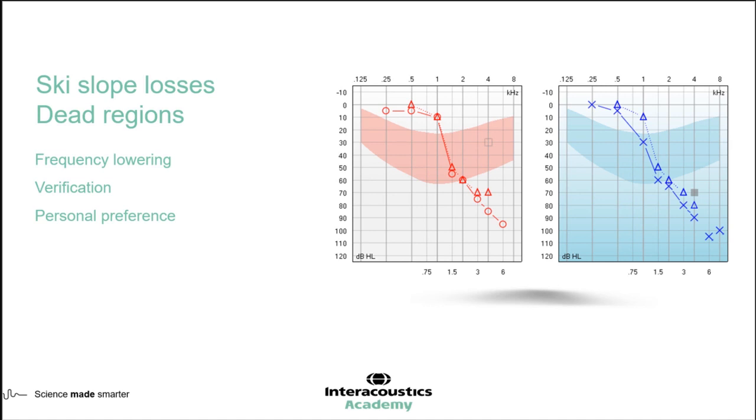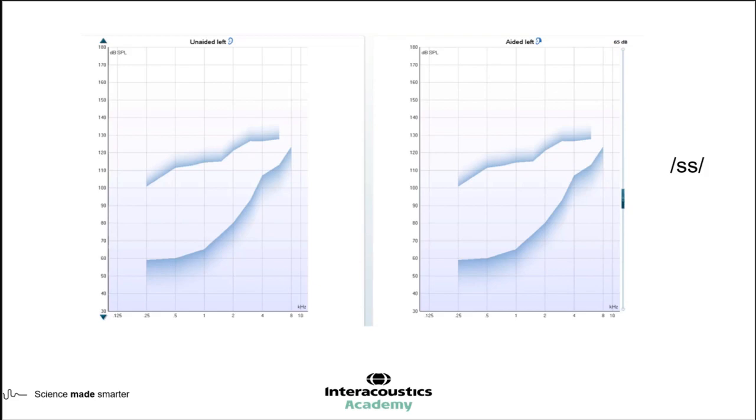Auditory deprivation can influence this, whether you've got asymmetries and how you set up frequency lowering for those individuals can be a very personal sort of preference. But I've got a video on this next slide that demonstrates frequency lowering in action.